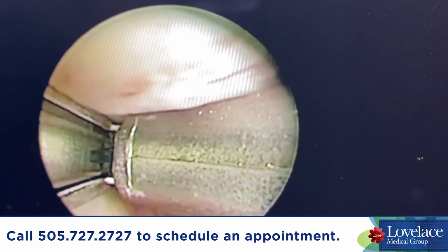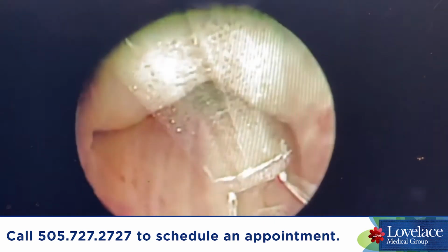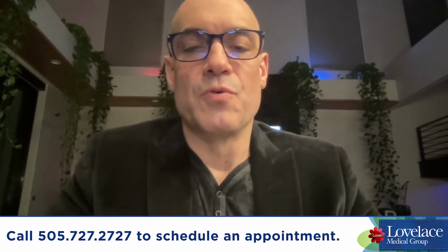It's advanced, and the one clip that's going to be placed on the inside of the urethra is then placed and deployed. So the next procedure is the Rezum procedure.